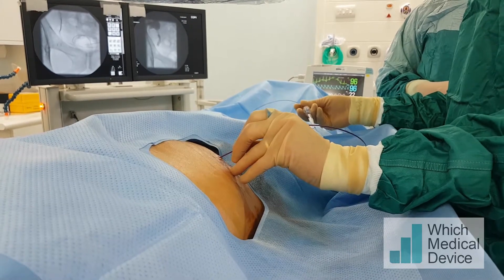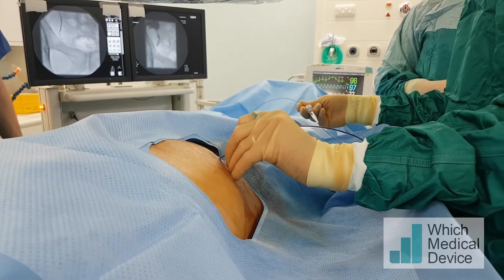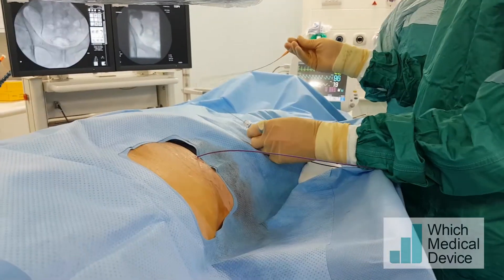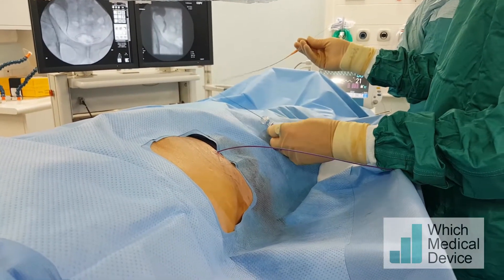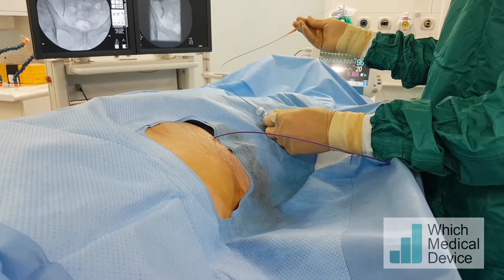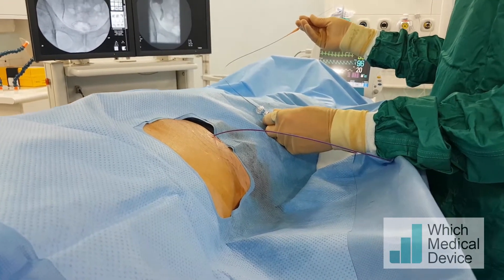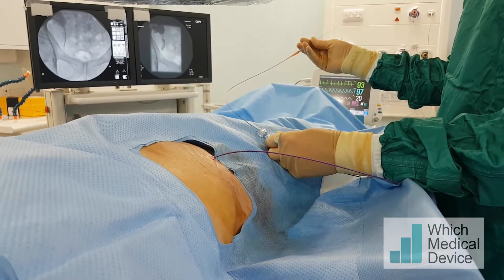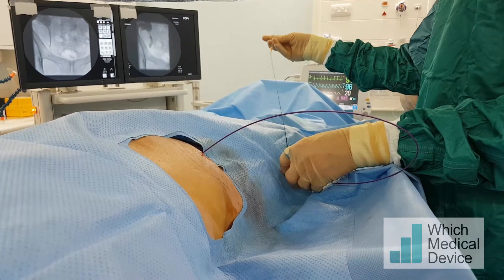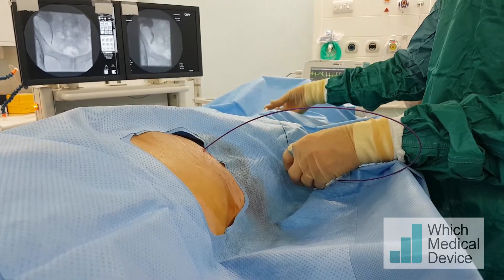I'm going to pull that loop back and try to rotate the catheter into the stricture. What we need to do now is withdraw both catheters over this guide wire so that we can insert a 9 French sheath, which will give us a lot more support and allow us to dilate the ureter and then put in an antegrade stent. So I'm withdrawing the micro catheter, leaving the guide wire in situ.